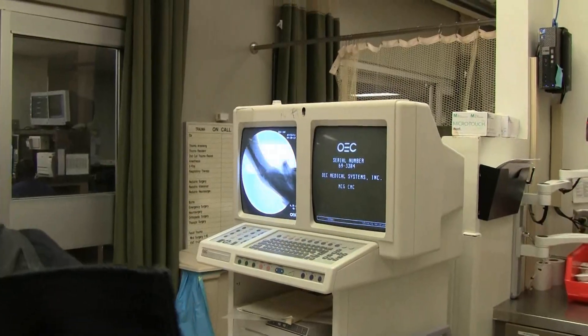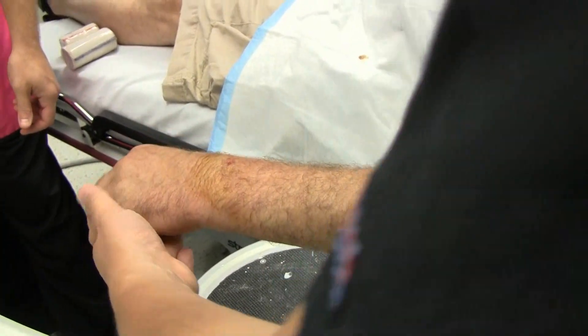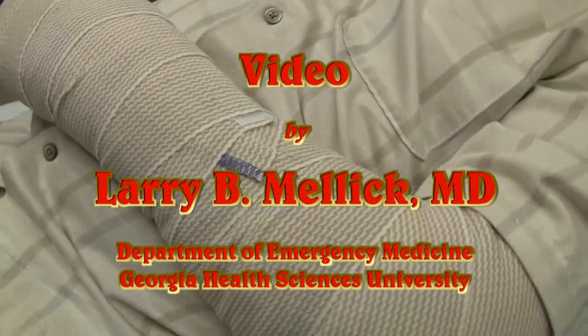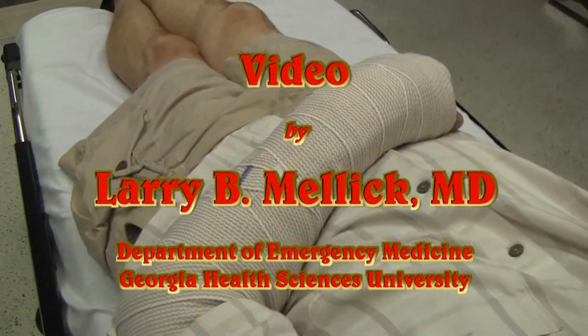Do you have another shot there? Are you happy with that? Good job. Go ahead. How are you feeling? Good. No pain? No pain at all.